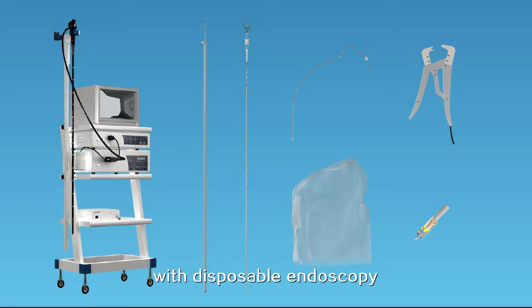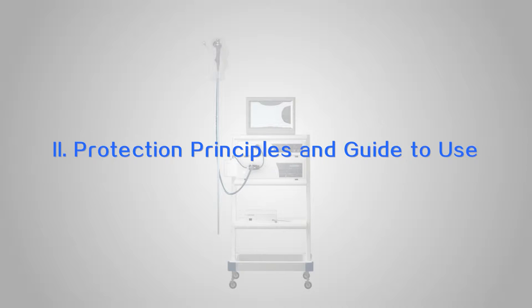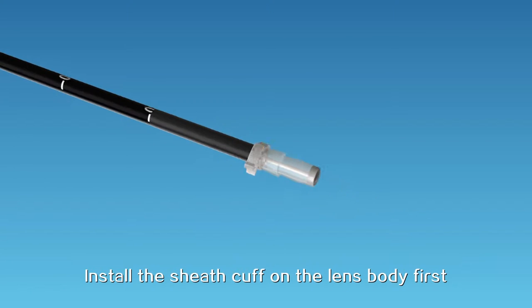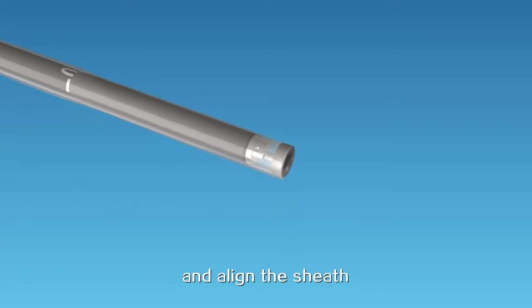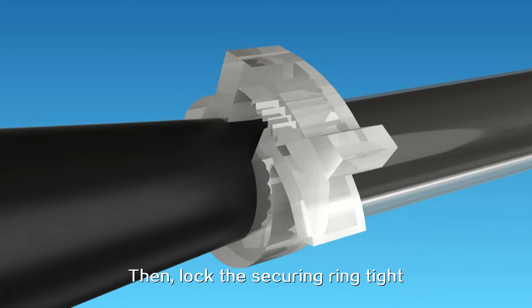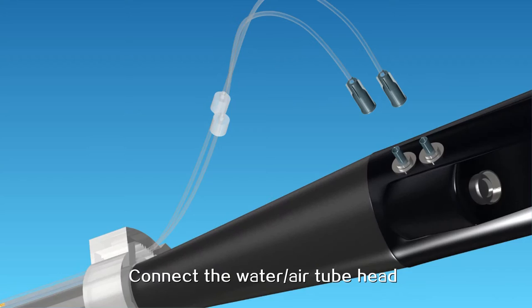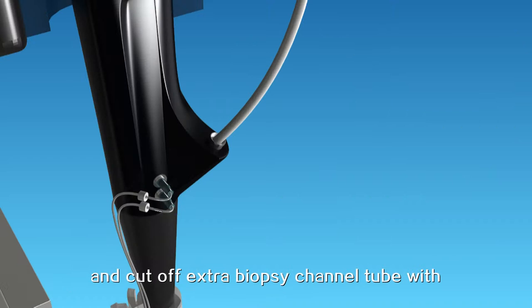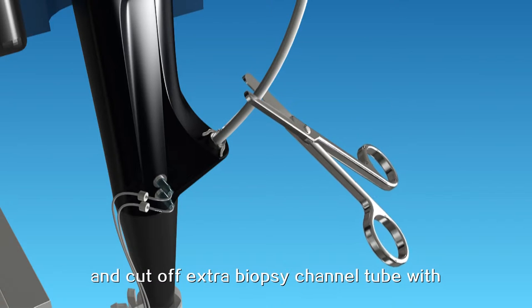The product has the same effect as disposable endoscopy. Protection principles and guide to use: install the sheath cuff on the lens body first, and align the sheath end with the lens head of the endoscopy, then lock the securing ring tight. Connect the water-air tube head to the joint of the lens body and cut off extra biopsy channel tube with a fixed-length shear.